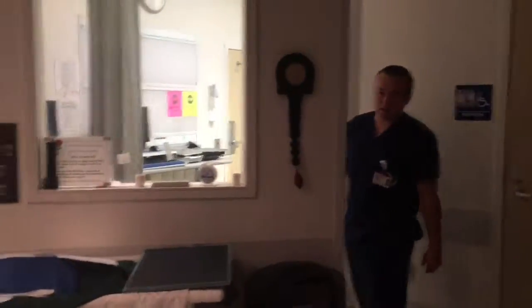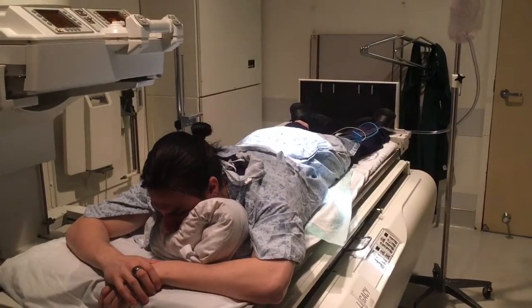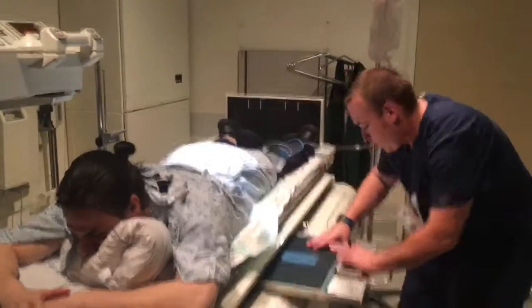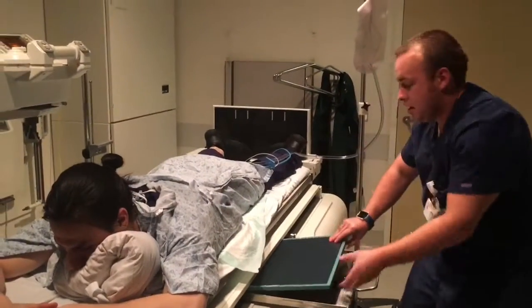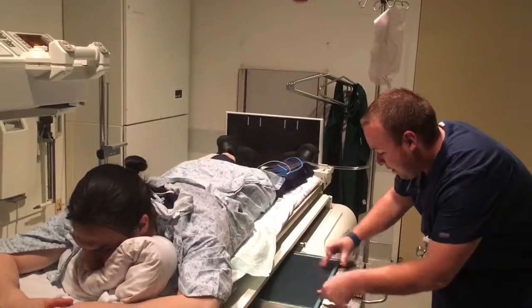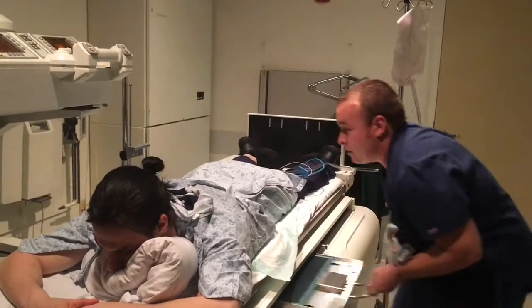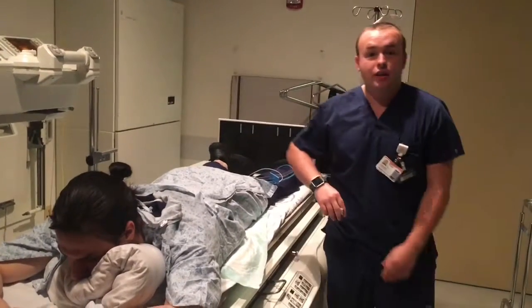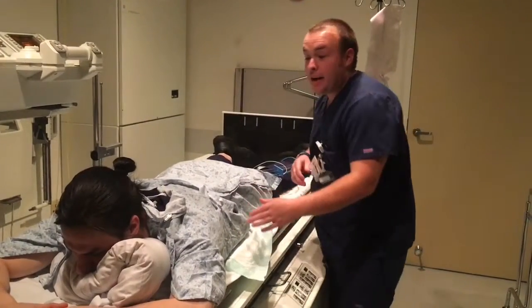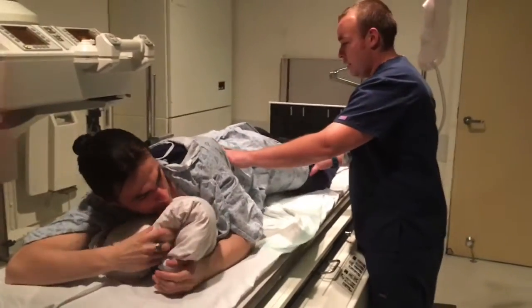Alright, Jared, take a deep breath, blow it out, hold, X-ray, breathe. Alright, so we're going to scan this one. Next image, same SID. Patient's going to go into a semi-prone position, and we're going to do an RAO, right anterior oblique. So go ahead, 45 degrees.